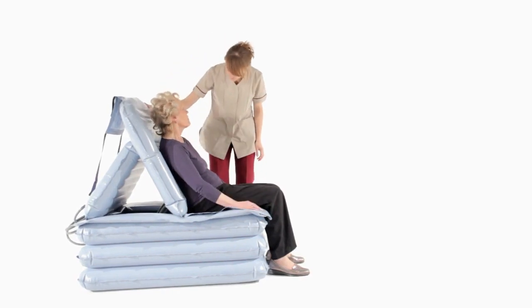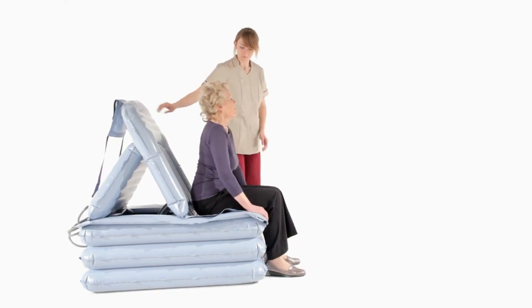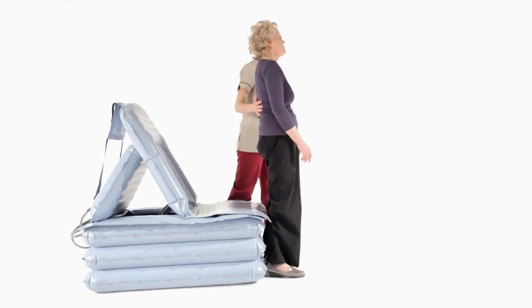Once the required number of levels have been raised, ensure that the backrest is now fully inflated. If necessary, the person can rest until they're ready to be assisted to stand up or side transfer off.